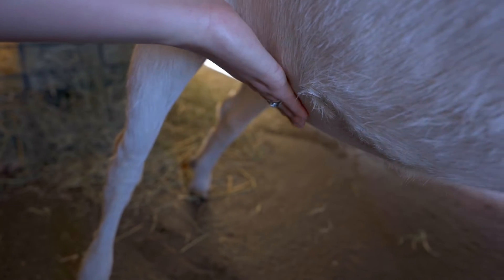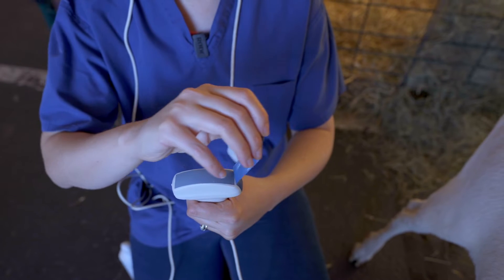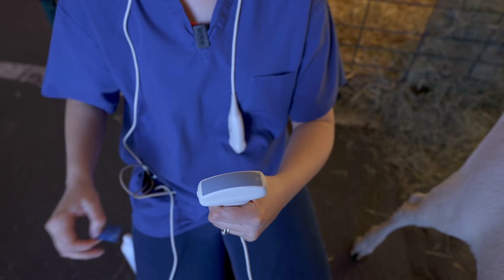If you've just received a brand new ultrasound machine, make sure you remove the tape from the head of the probe. I'm going to now apply gel to the head of the transducer.